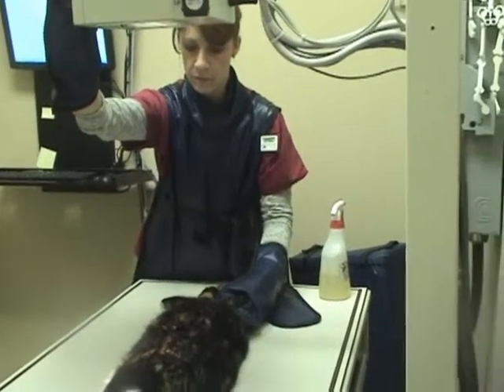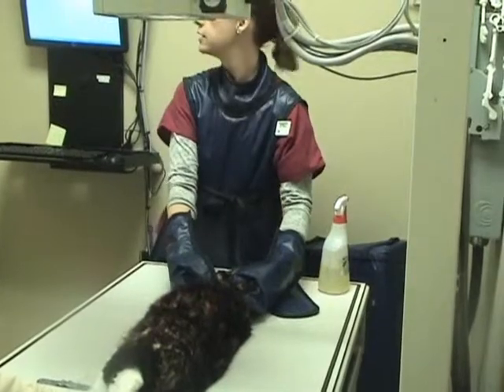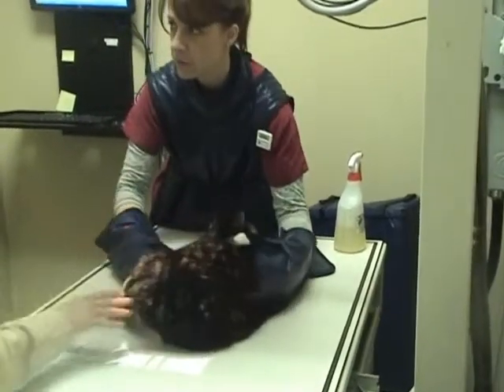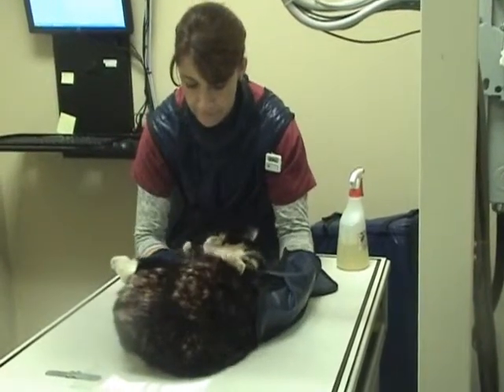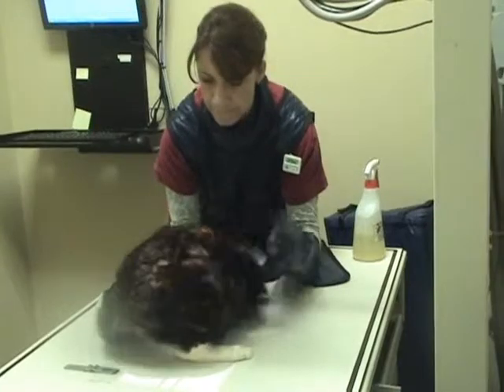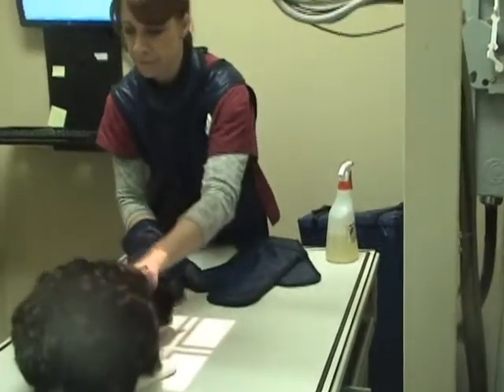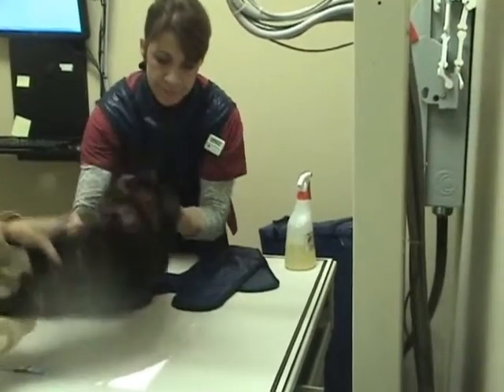You also want to make sure that you collimate appropriately to minimize the amount of scatter radiation. You also want to remember to wear your personal protective equipment. That includes the use of gloves, your gown, and your dosimeter badge, and you also want to make sure that you lean away from the primary beam and do not look at the primary beam when taking the X-ray.